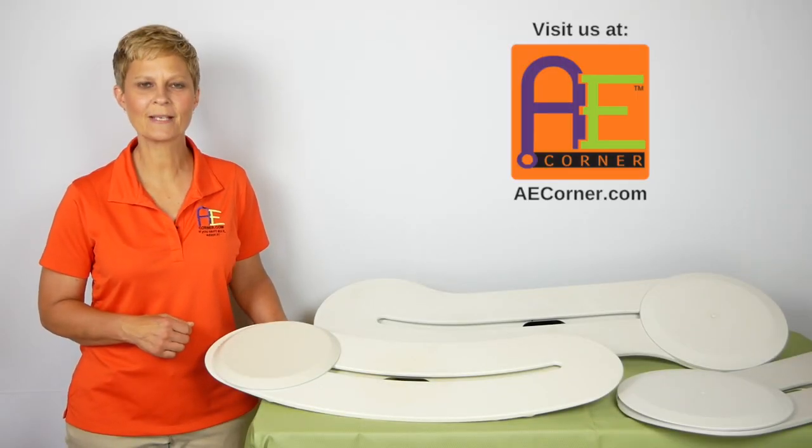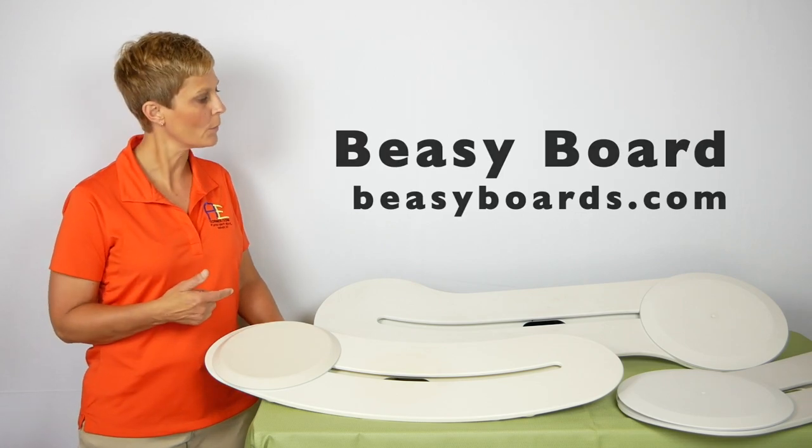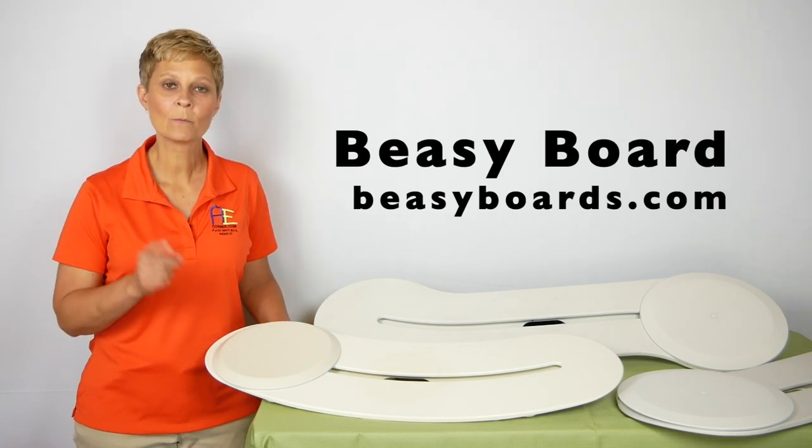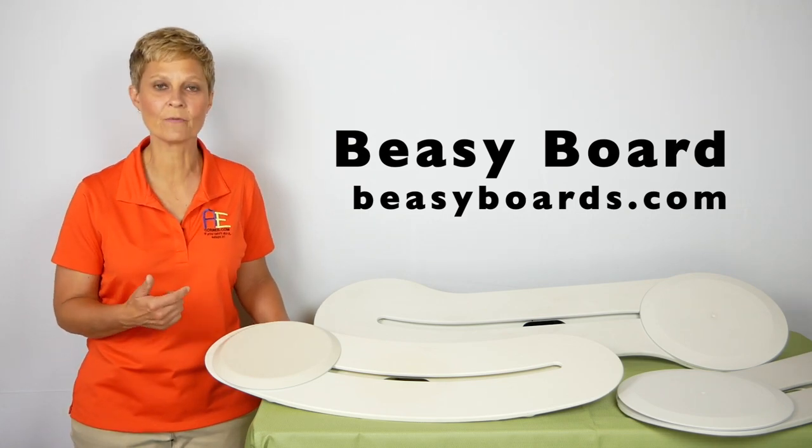Cindy here, Physical Therapist with Adaptive Equipment Corner. Today we're going to do a review video on the Beasy Board, which is a transfer board. We want to say thank you to Beasy Board for sending us some samples so that we could do this review.